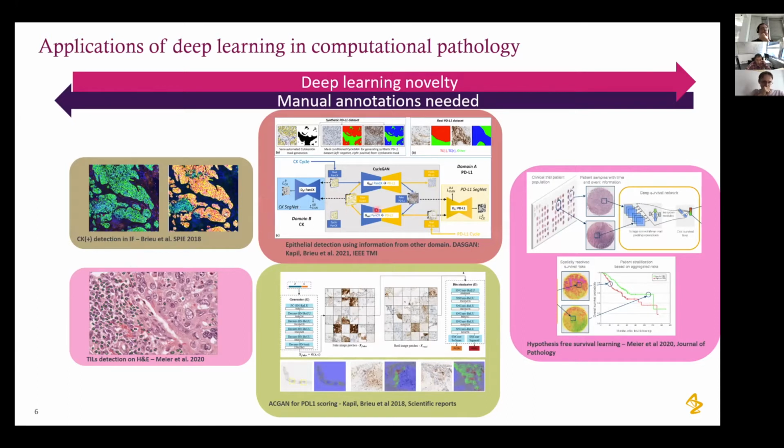Here in the middle, we have some semi-supervised methods where we have very few annotations from pathologists, and we try to obtain or synthesize some annotations automatically from other domains. I will talk about this work in detail in this talk.